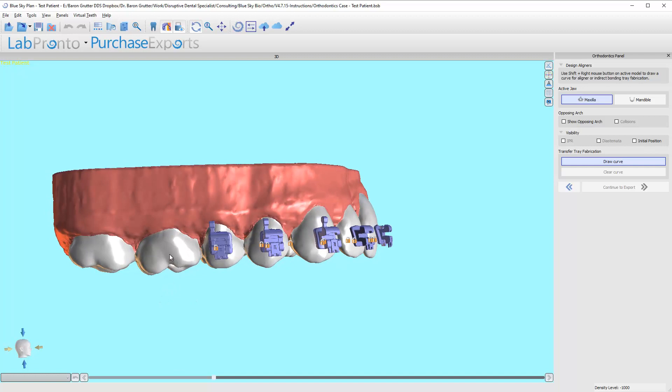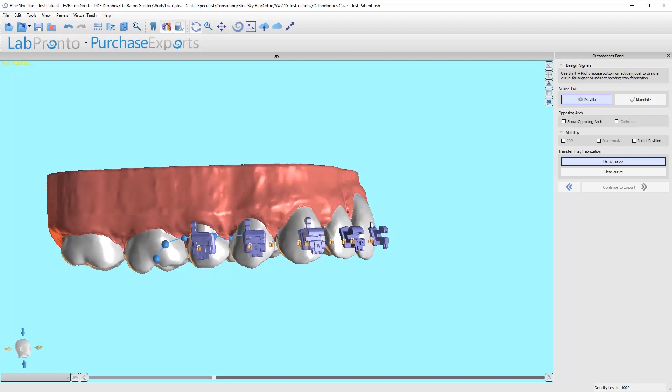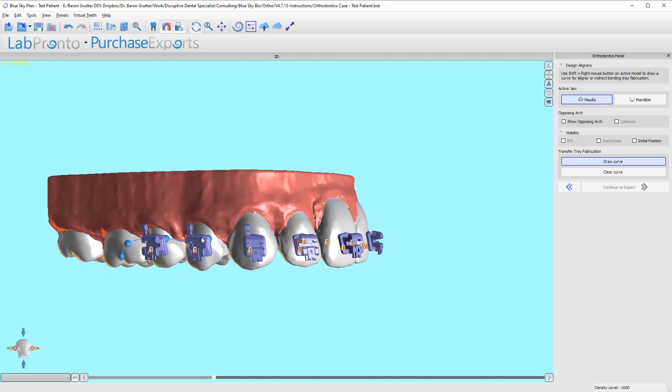Notice that when I press the shift button, my arrow turns into a crosshair. Now I'm going to draw this line, and I like to go right over the gingival aspect of the bracket. You don't have to.